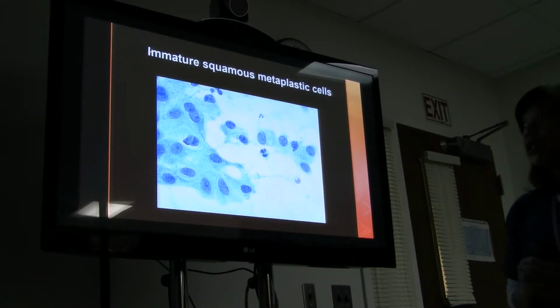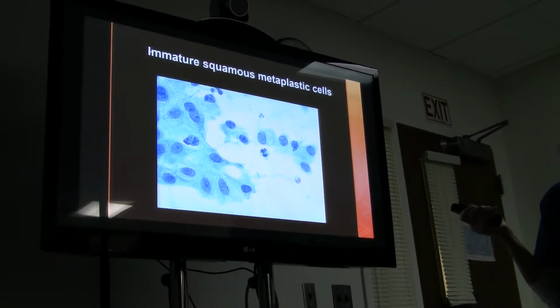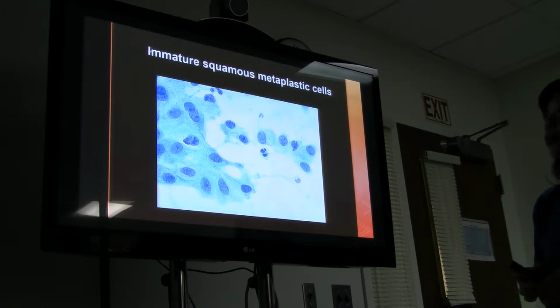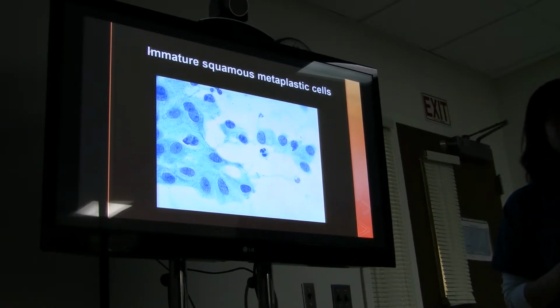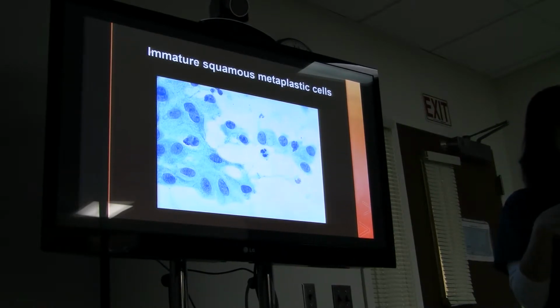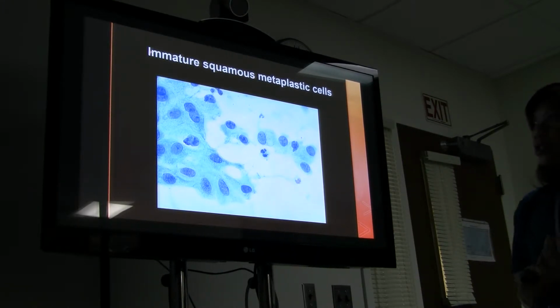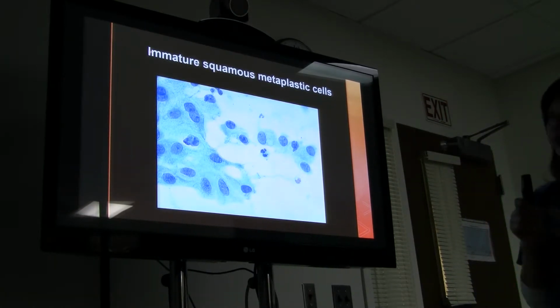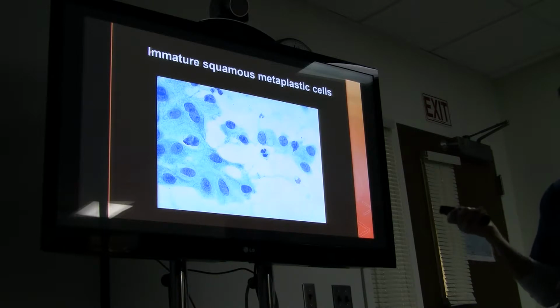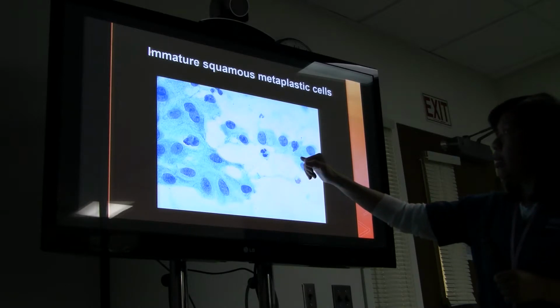Now, to determine what specific type of cell it is, we look at the cytoplasm. The texture of the cytoplasm is very important. We talked earlier about how squamous cell cytoplasm is more dense, surrounded by a nucleus in the center, whereas in glandular cells and metaplasia, the texture of the cytoplasm could change. It could be foamy, a little bit granular, or a little bit dense. It has both characteristics. So this one, the texture looks kind of grainy, right? We call it granular cytoplasm. They still have a very nice round nucleus.